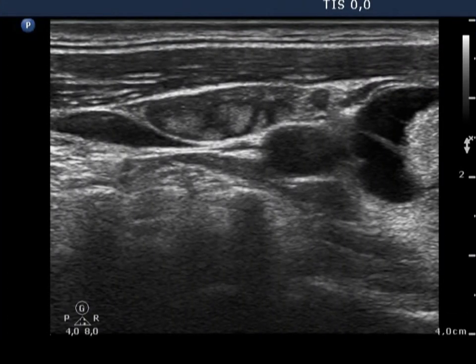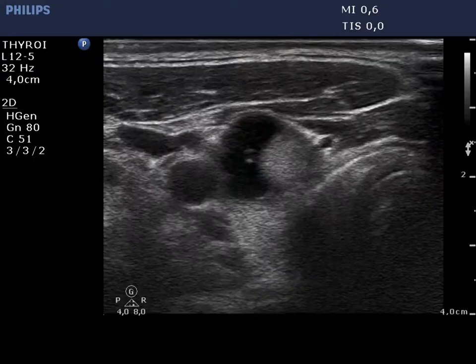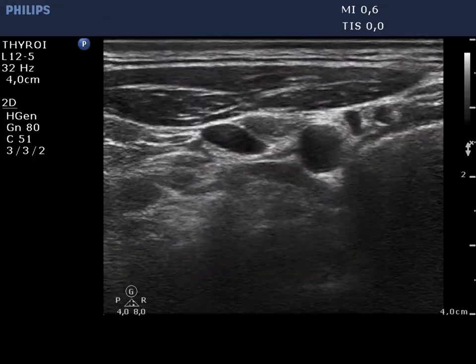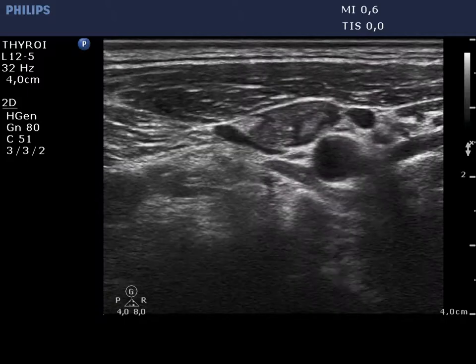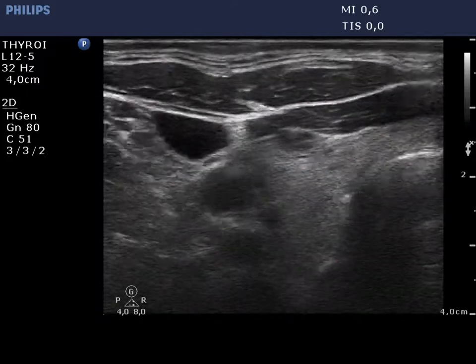There is a metastatic lymph node lateral to the right lobe with increased vascularization. The right lobe and the lymph node are seen in the video.